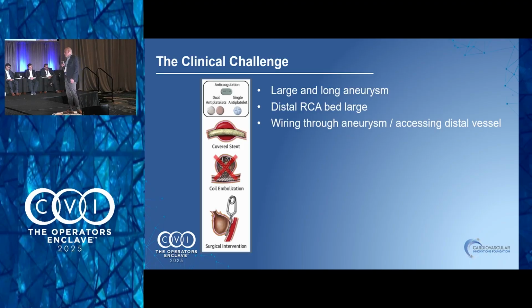So, what do you do about this? I think we could just decide to treat this medically. I really don't think this had anything to do with this continuous blood coming out of his chest tube, but maybe they nicked something and it is a big mass. But it was pre-existing if they did. I don't think, like I said, on that CT already.